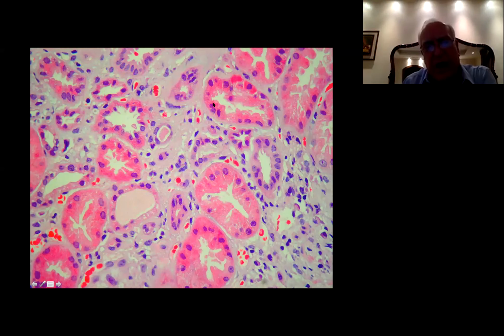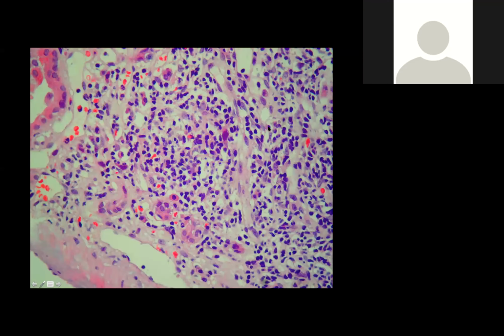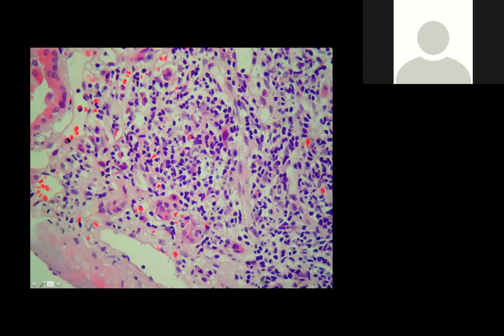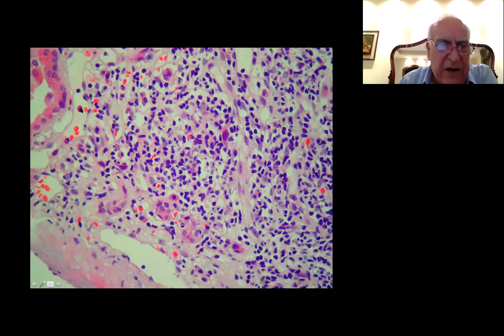Here we come to a large area of interstitial infiltrate that was present, which is mononuclear cells, some plasma cells, and there are some eosinophils that you are seeing. Eosinophils are clear in the specimen, yes. Okay, there is one eosinophil here, that's one polymorph, that is a plasma cell. So some eosinophils, as you'll see.